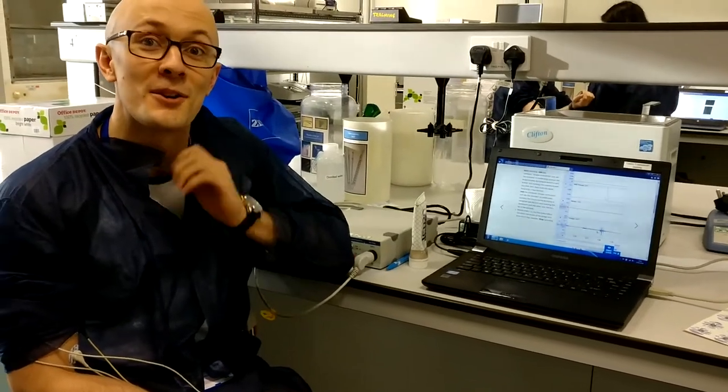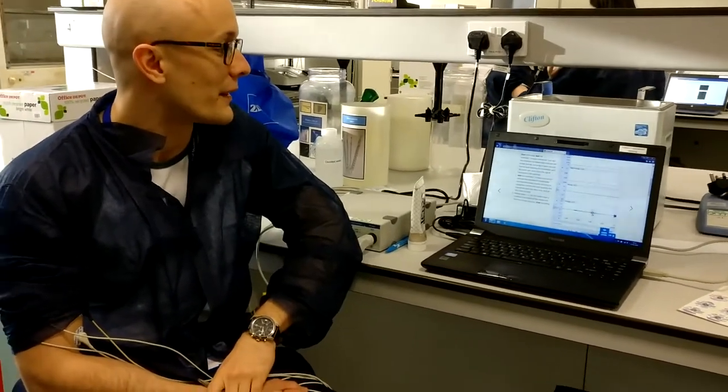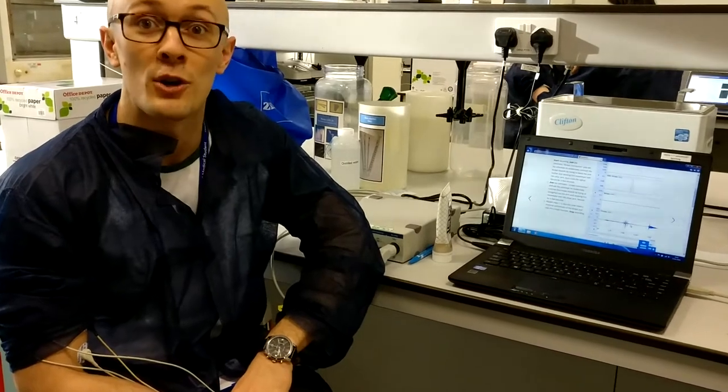Are we rolling? Yes. Hi guys, it's Tom. We are in the lab at the moment and we're taking an electromyogram.